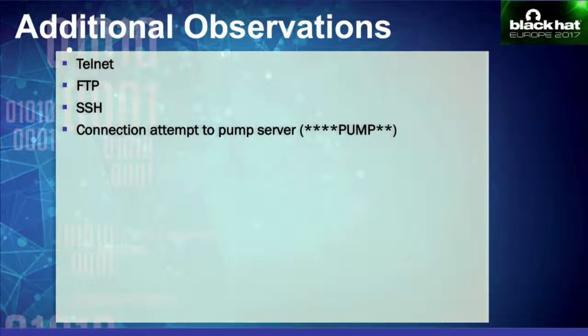Once that was done, we also installed Wireshark on it to capture network traffic. As that happened, we saw that the Infusion Pump instantly tried to reach out to the pump server. Now it could resolve the name of the pump server, so it started sending some packets to it.